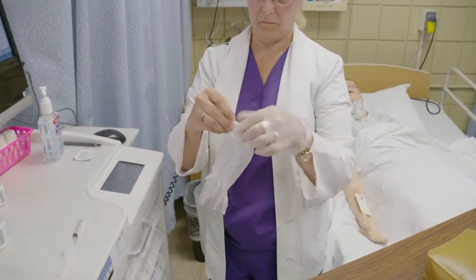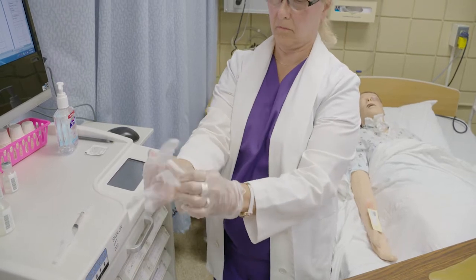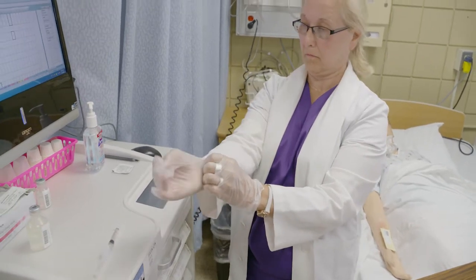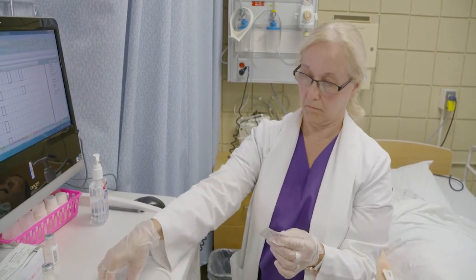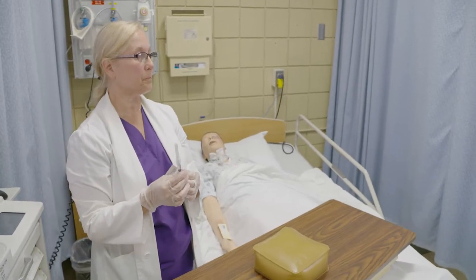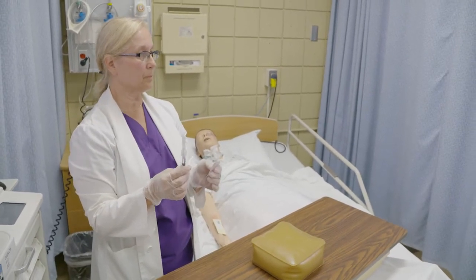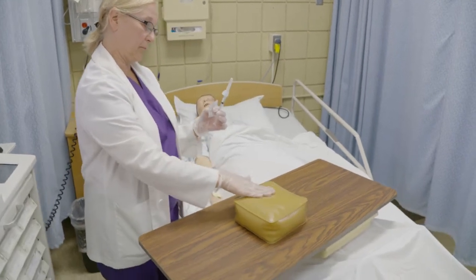Select the appropriate site for injection. Sub-Q medication is injected at least 2 inches from the umbilicus on either the right or left side of the abdomen. It can also be given in the back of the arm or the top of the leg in the fatty tissue. So palpate for any masses or tenderness.